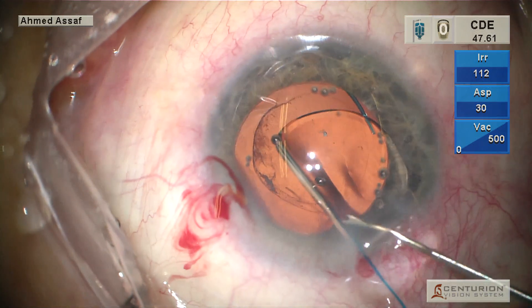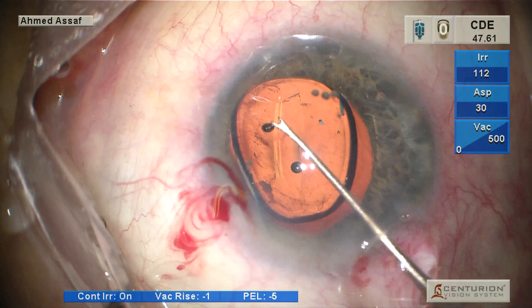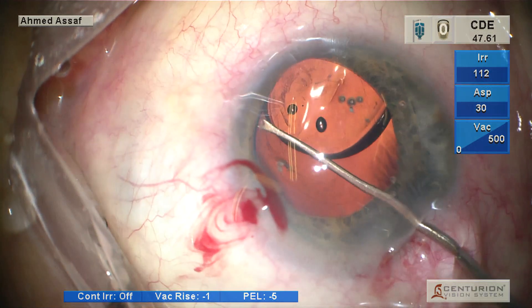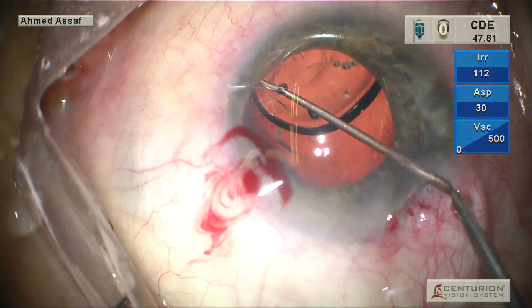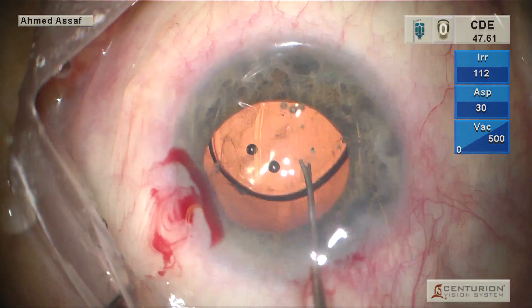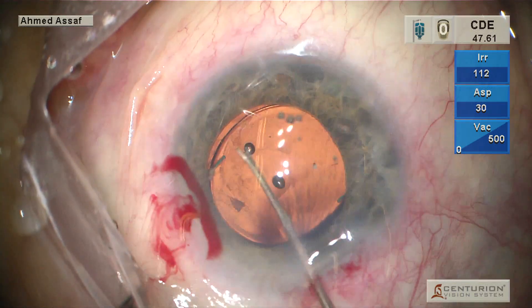We can further push this lens into the anterior chamber. Then we can direct this haptic into the sulcus. We have many ways to direct this haptic into the sulcus, either by rotation of the lens, or we can just do flexion of the haptic by a Sinskey or Kuglen hook.